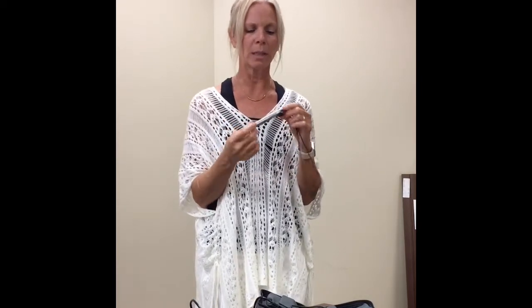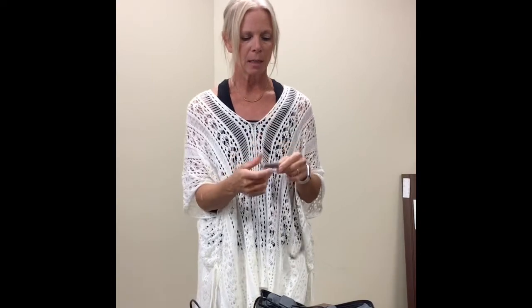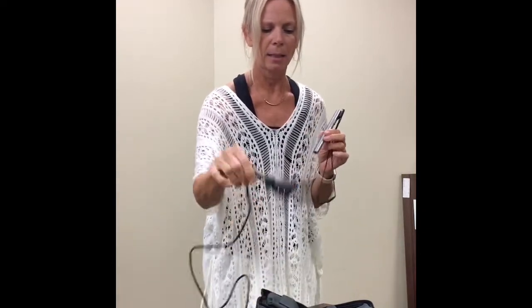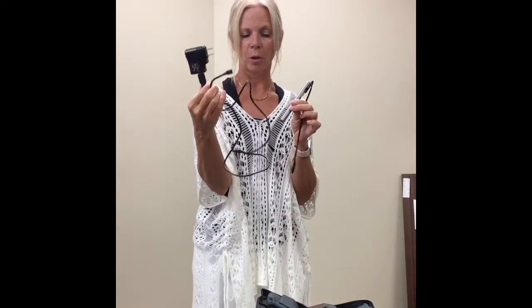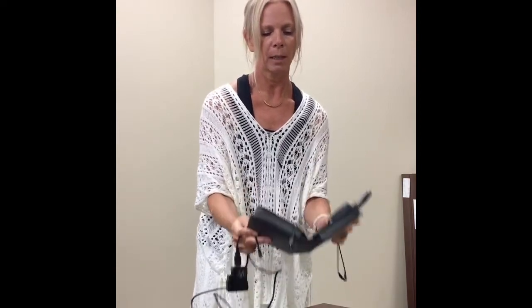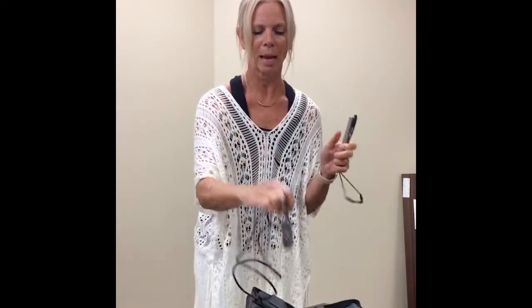Now, you do need to know how to charge the microphone. The microphone needs to be charged every day. So how this microphone is going to be charged is it has a basic cell phone style charger that comes with it. It'll all be inside of a case like this.